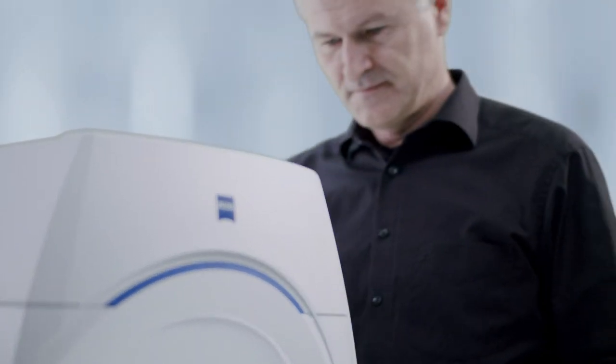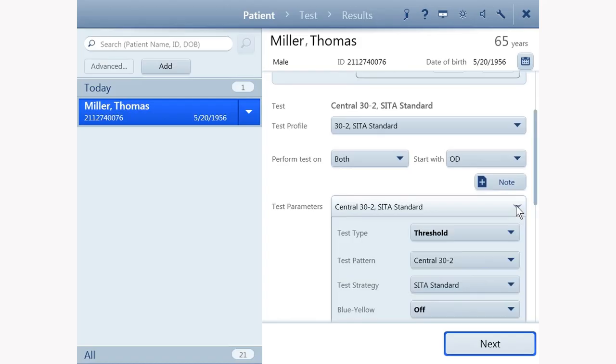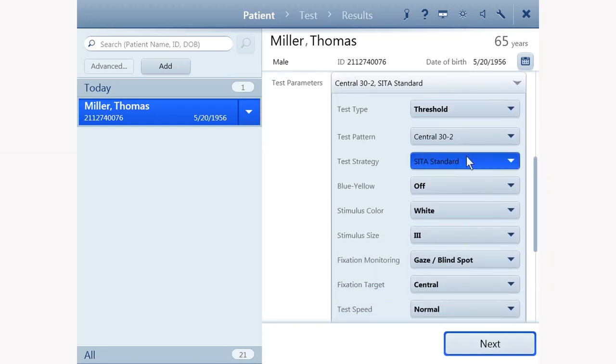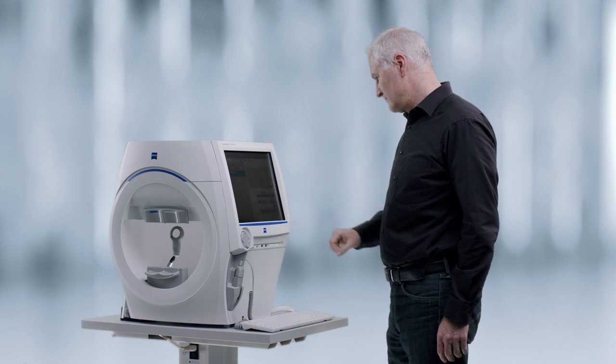Review the selected patient name, date of birth, and refractive correction information. Adjust the values as necessary. Select the correct test and any other testing parameters that need to be changed.